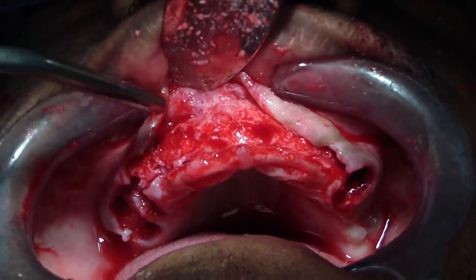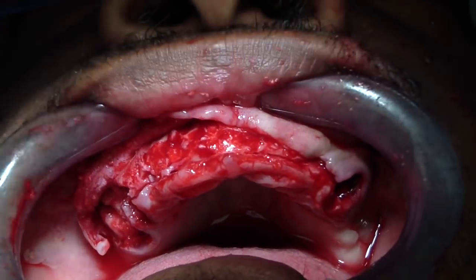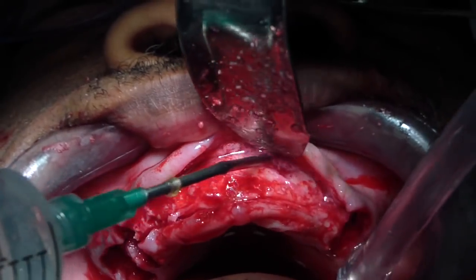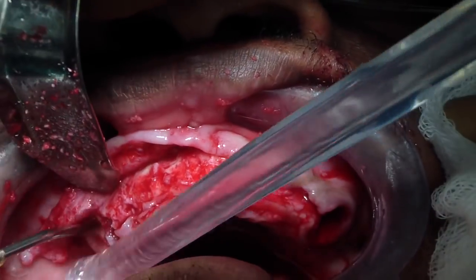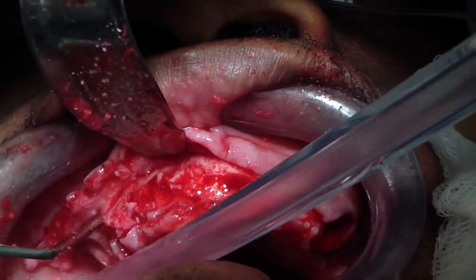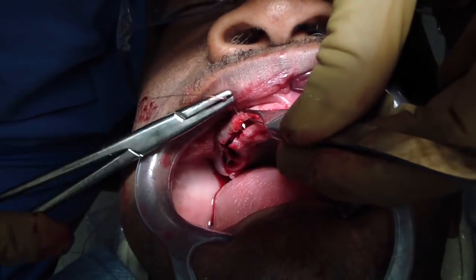I was reading in Peterson this morning — he acknowledges that it is important to remove any debris to prevent slowing down the healing process, so we can decrease the amount of time between surgery and prosthetic rehabilitation. We rinse first, suction underneath the flap, then do two more rinses. We now have a plastic suction tip called a Yankauer — it's a really fast way of removing the irrigant from the oral cavity.